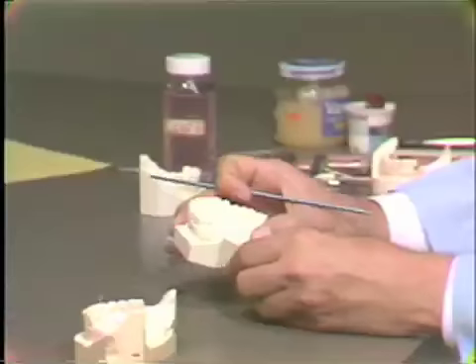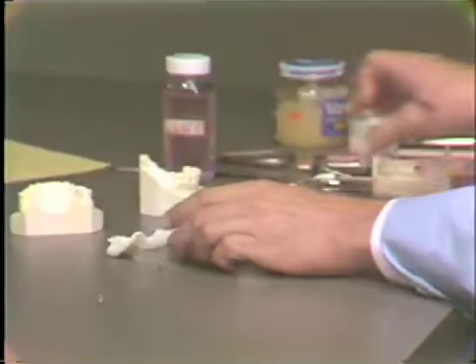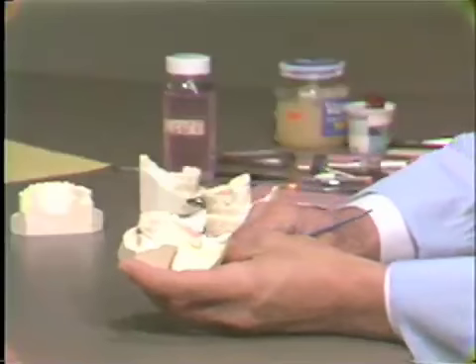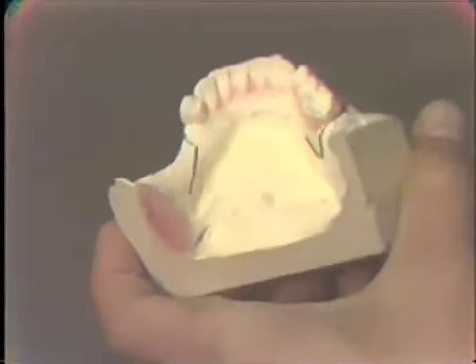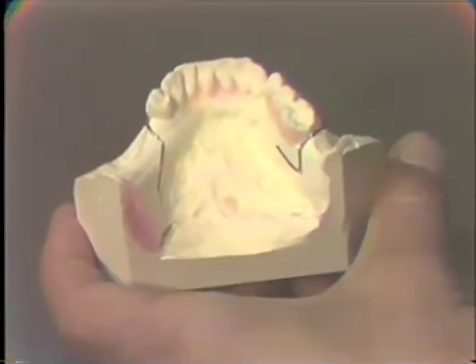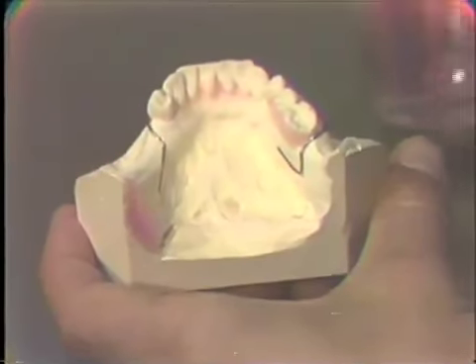So when we have all the wires bent for this patient, we would have to, number one, lubricate the cast with a tin foil substitute or by placing tin foil.